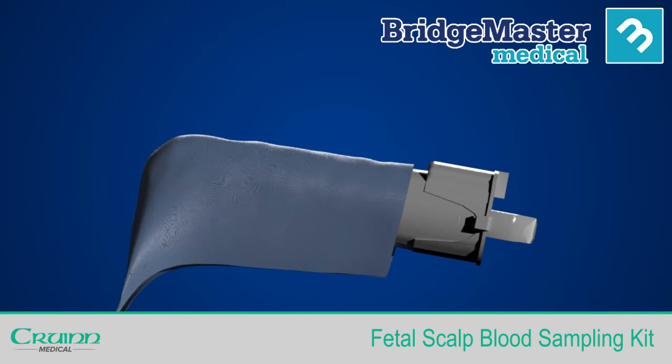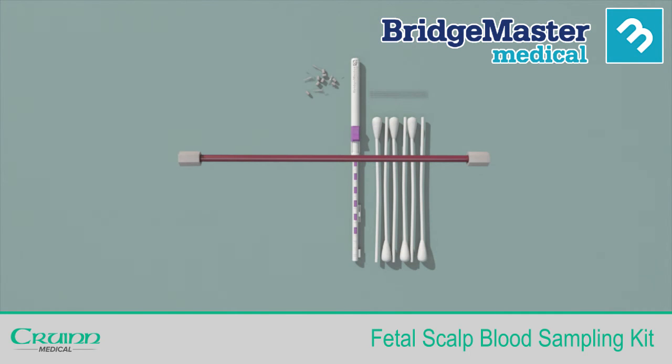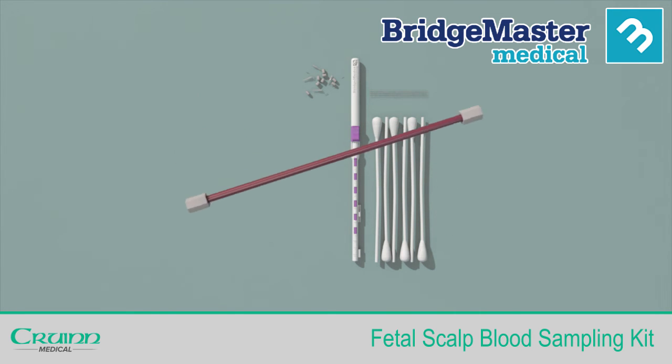Clean with an antiseptic wipe and place with the kit. If you expect any delay in delivering your sample to the blood gas analyser, gently shake or rotate the capillary tube to help avoid any clotting.